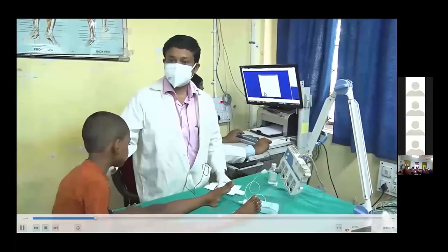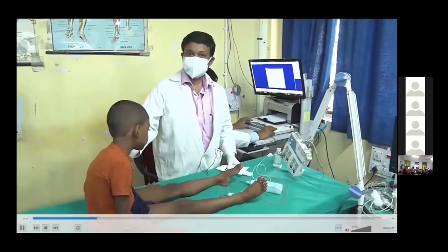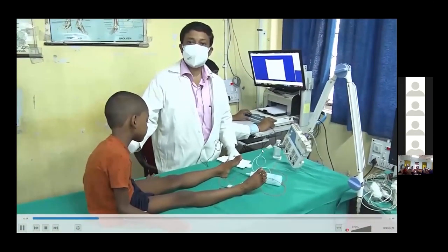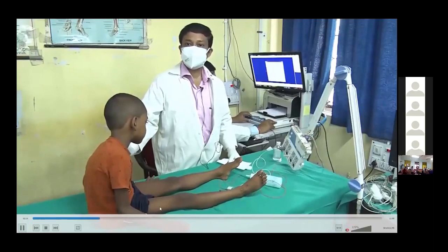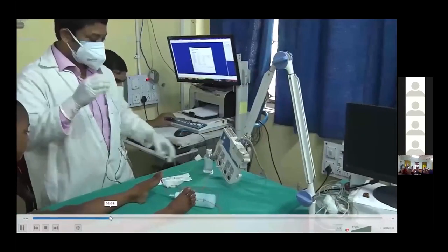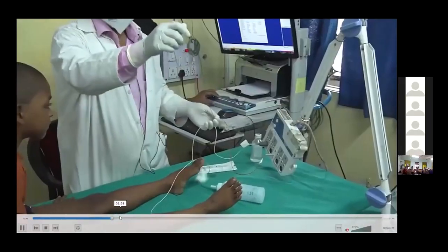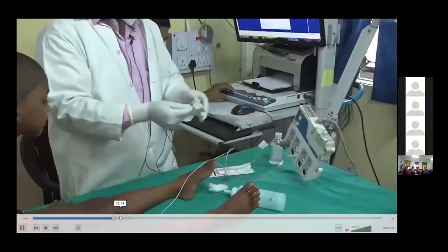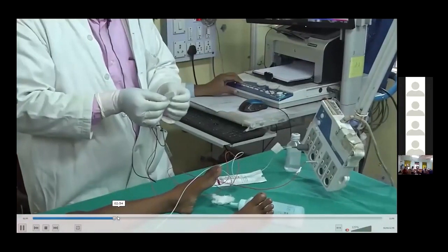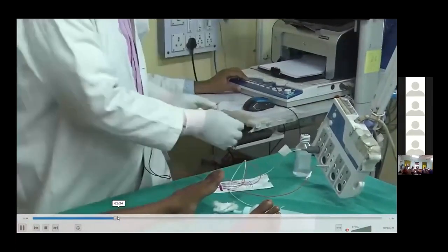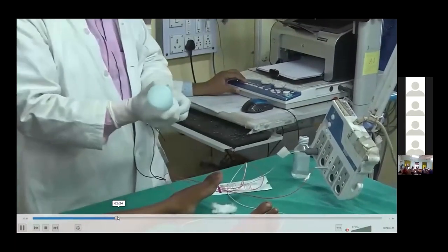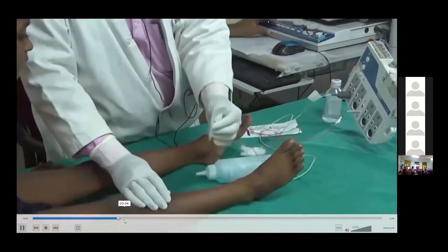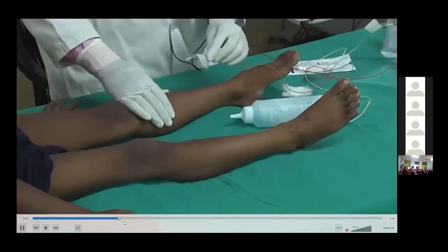You can see this is a monitor. And the needle has been connected. I'll just go rapidly because of lack of time. So this is the EMG needle. The pediatric EMG needle has been used.